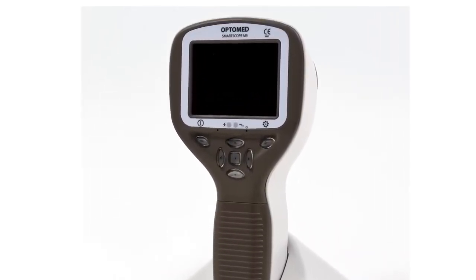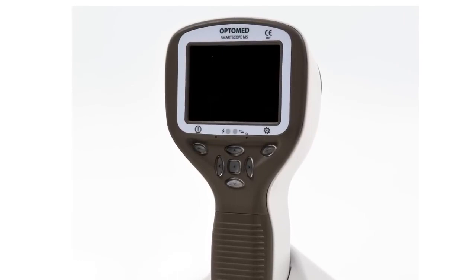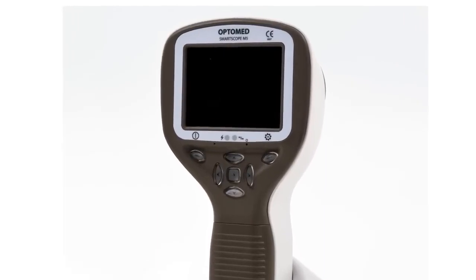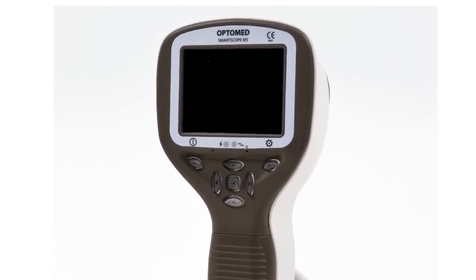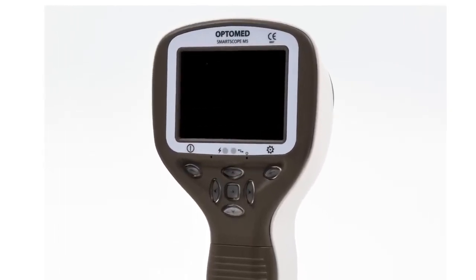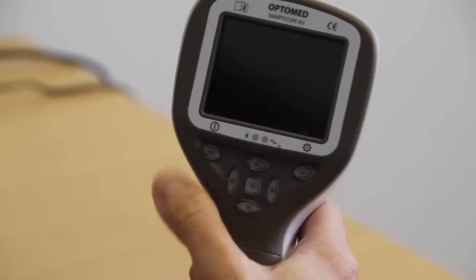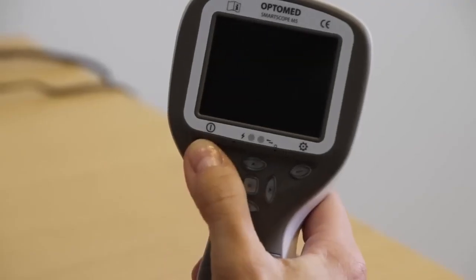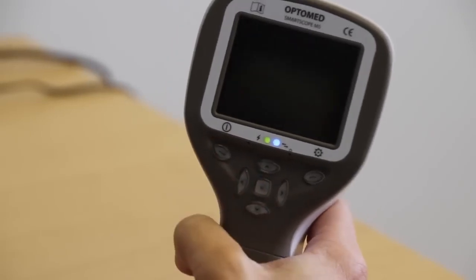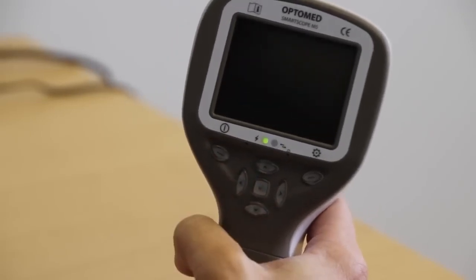First, let's go through the basic use and settings of the device. Power on and off the device by pressing the left soft key.